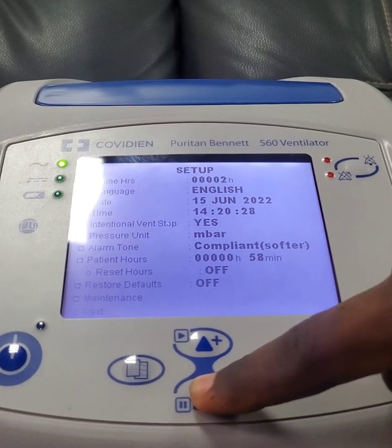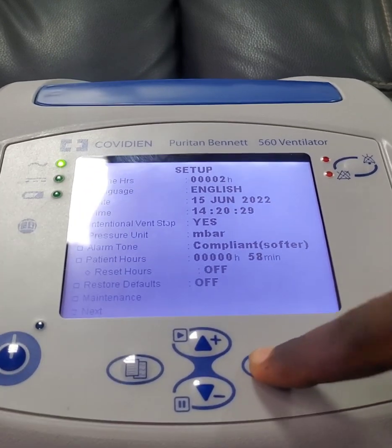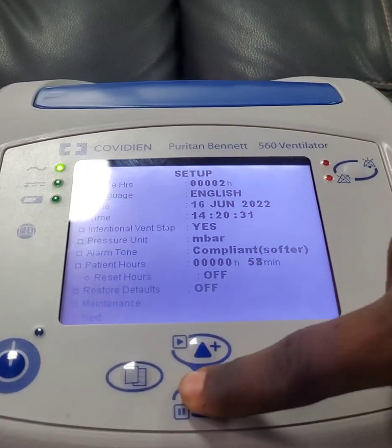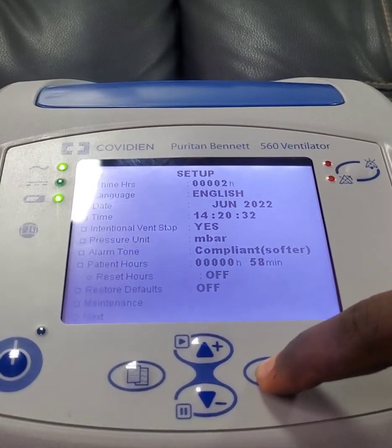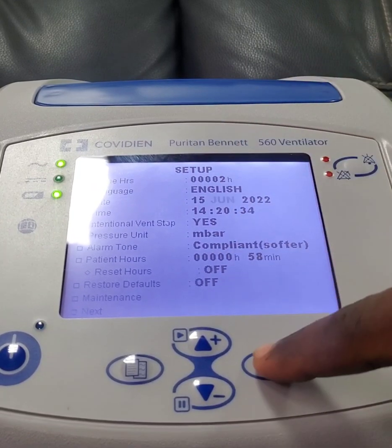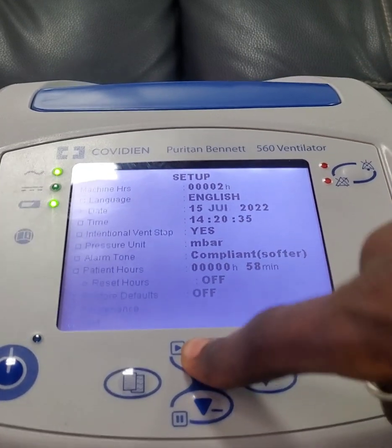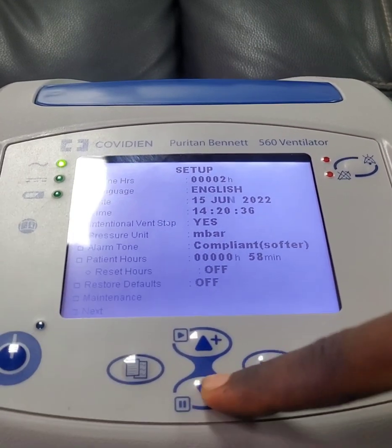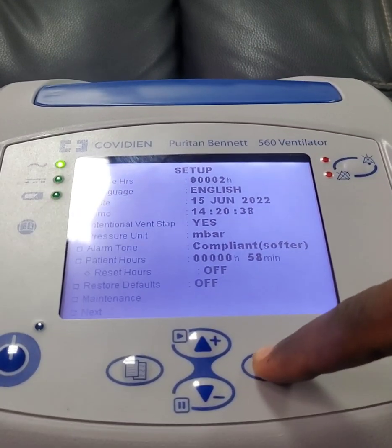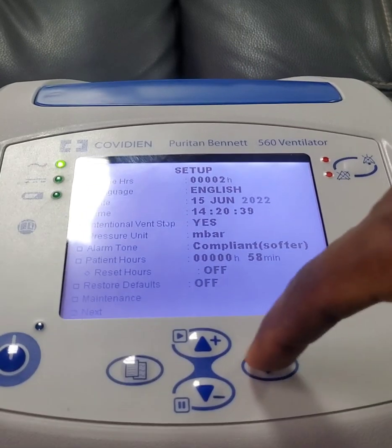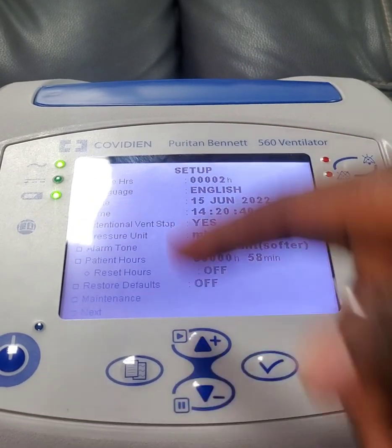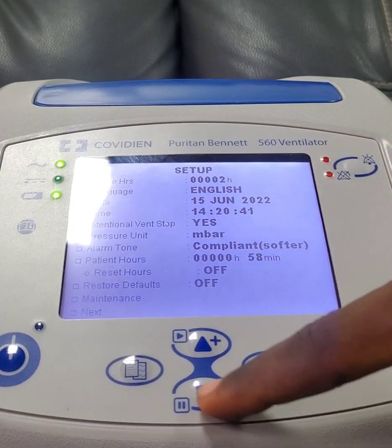Then this is the date — you can change the date, you can change the month. Then you can come to time and change that the same way.